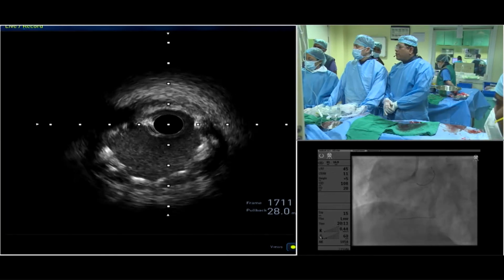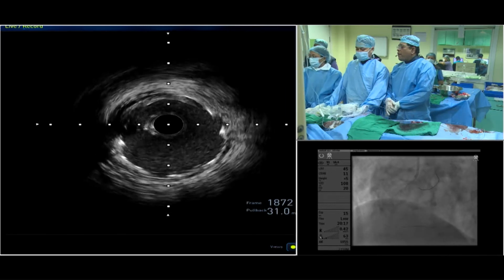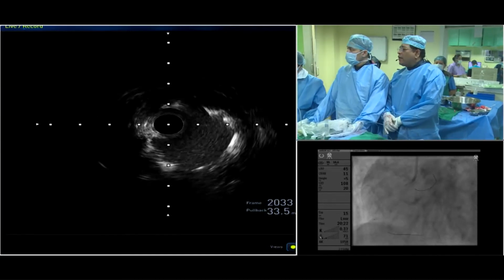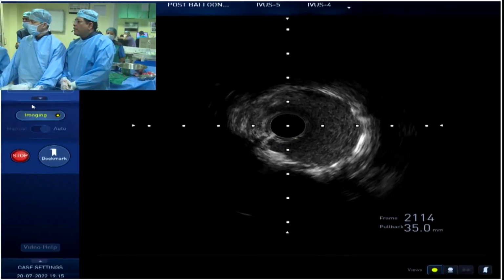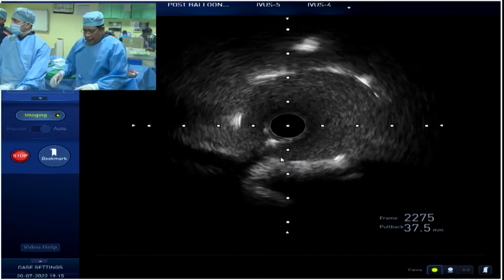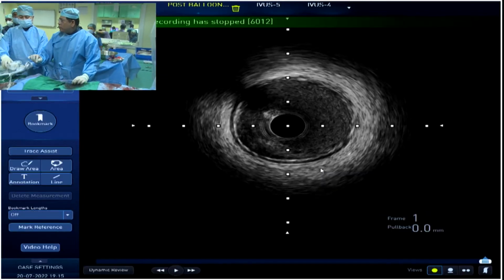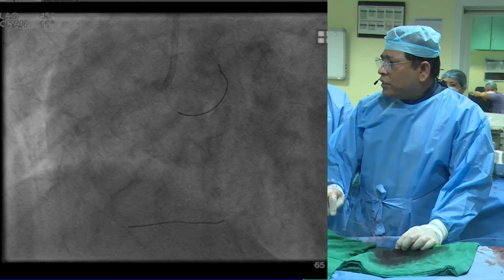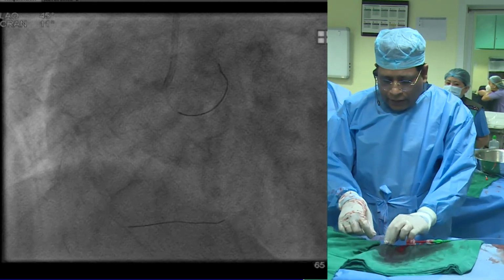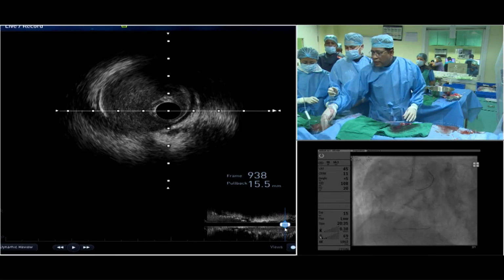So that's what it was showing, and here we are is a good position here and a good MLA, good MSA. And it is ostial, you see ostium, we have to be, stent is still there. So stent is still there, see. So we are in the ostium, that is very important. And we can go little more, and the distal segment of the placement of the stent was perfect, okay. So where we try to land, so distally there was also a plaque. So we didn't want to go there because it would have been a very large stent, and nowhere that lesion was looking significant. And you appreciate everything looks so good here now.